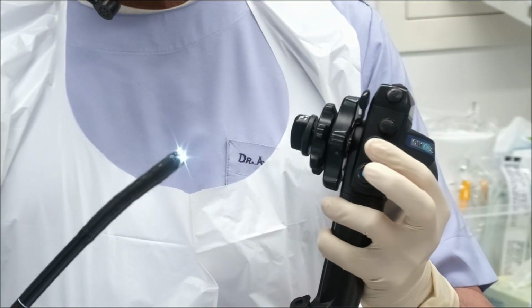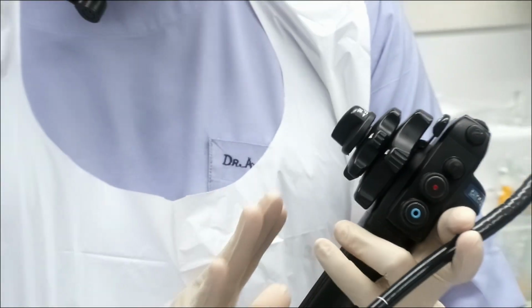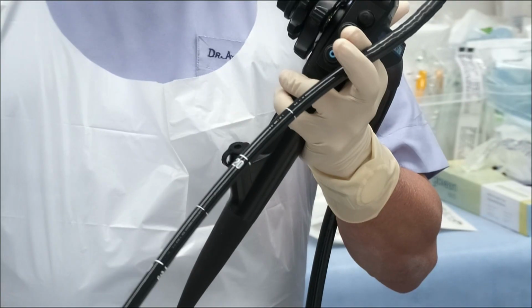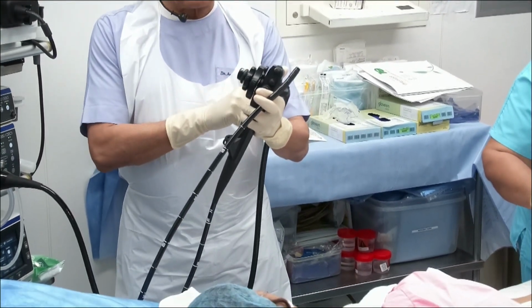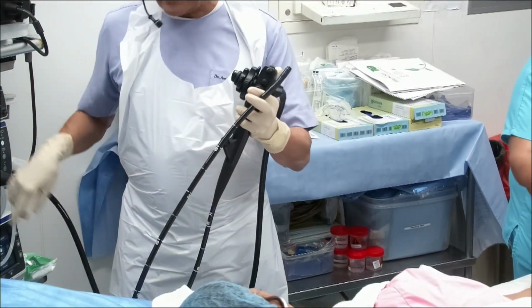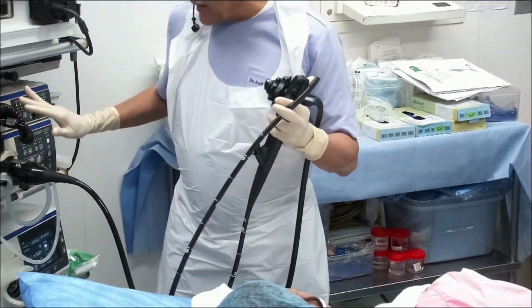So these are the various parts of a scope. Once more I will tell you, this is the control section. Ahead you see is the insertion tube, which is going inside the patient. Behind you see is the connecting tube, which is going inside the processor and the light source. And that is the light source and the processor.